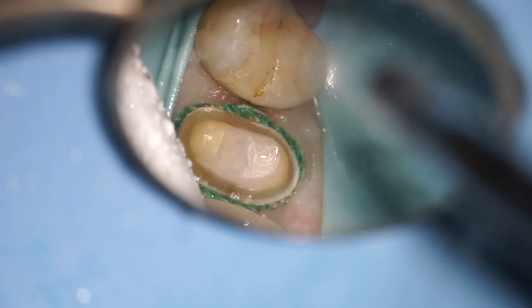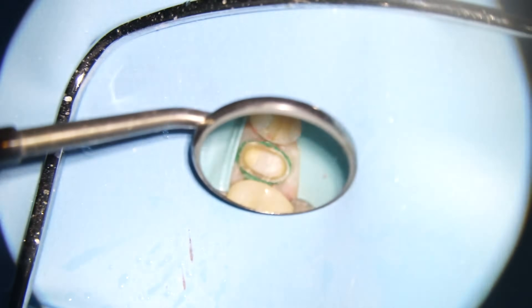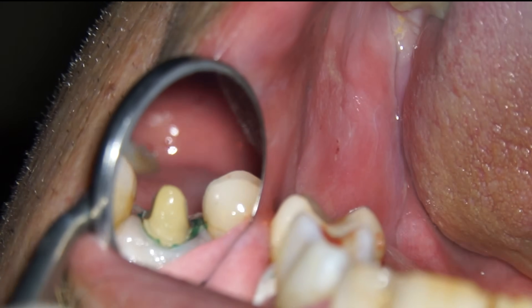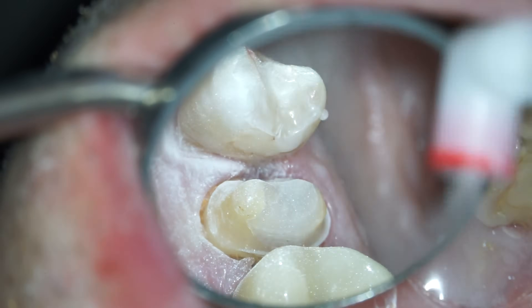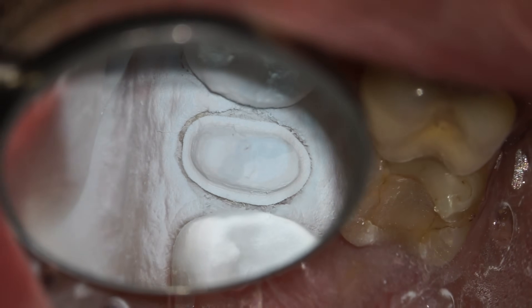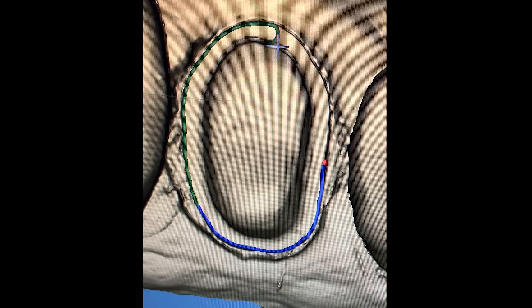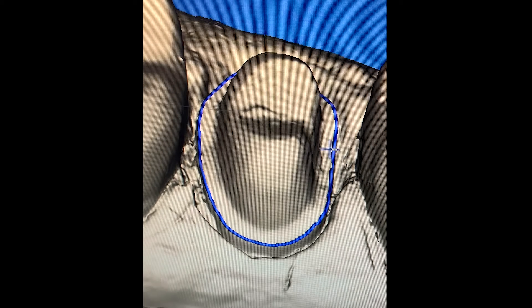This is what the tooth looks like after it's been trimmed and polished. Before we can get a crown on there, we need to actually send information to the lab so that they can make it. But first, I want to make sure I have enough space between the crown tooth and the ones biting against it. Then I spray some imaging powder onto the tooth, make sure everything's clear, and take some digital images to create a 3D model, which the lab then uses to make a crown. It's milled out of a block of porcelain and sent back to us the same day.